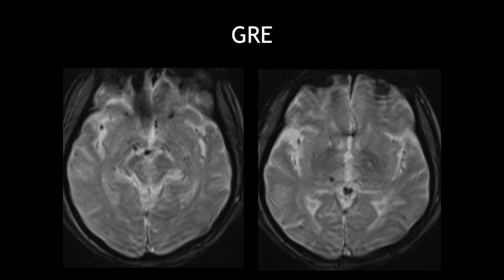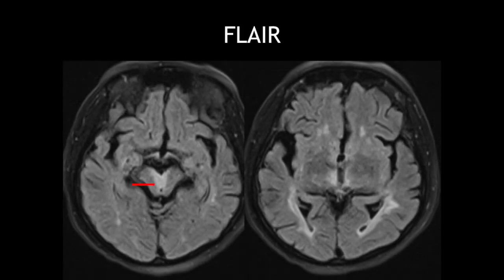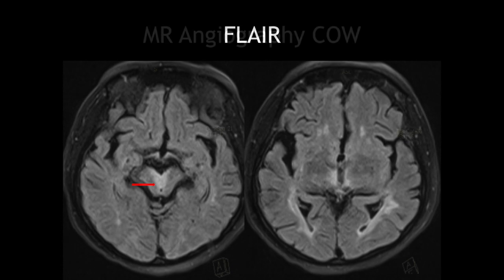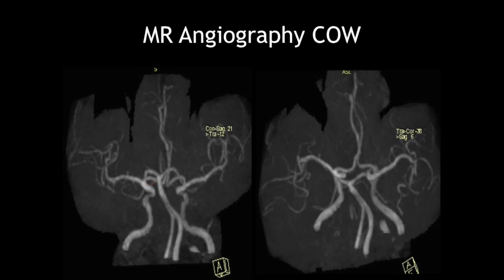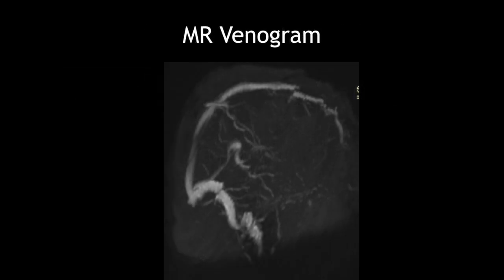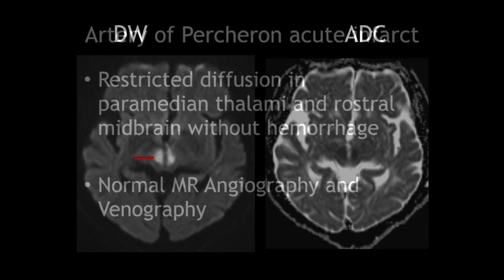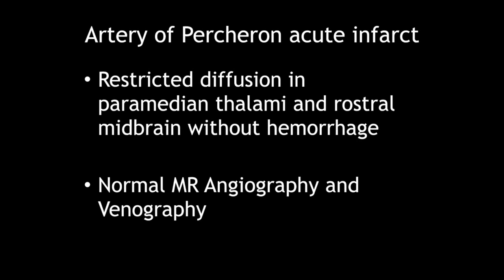No blooming was seen to suggest hemorrhage, and the lesions appeared hyper-intense on FLAIR images. MR angiography of the brain did not show any abnormality, and neither did the MR venogram. This restricted diffusion in the paramedian thalami and rostral midbrain with normal angiography and venography was suggestive of an artery of Percheron acute infarct.